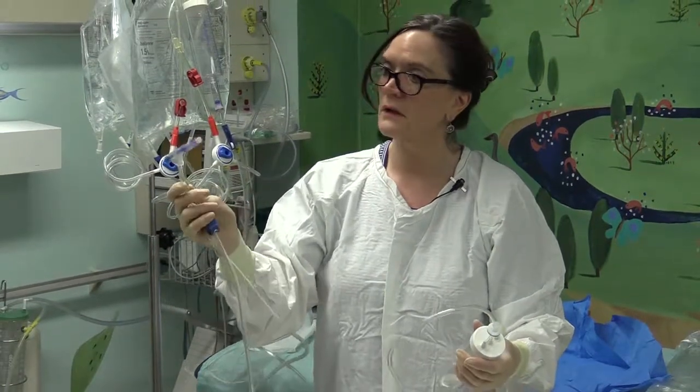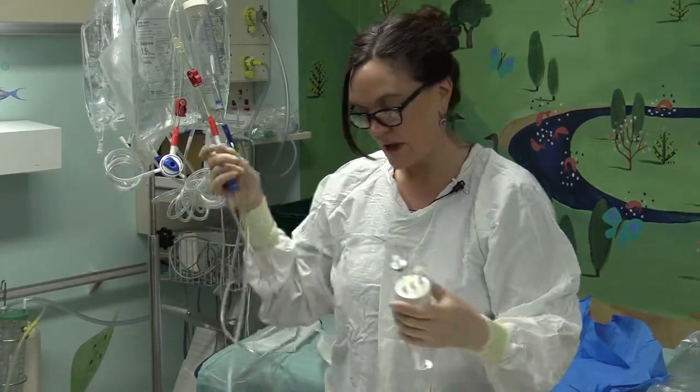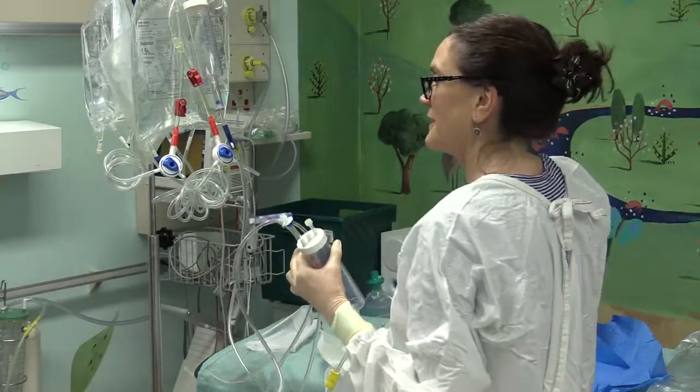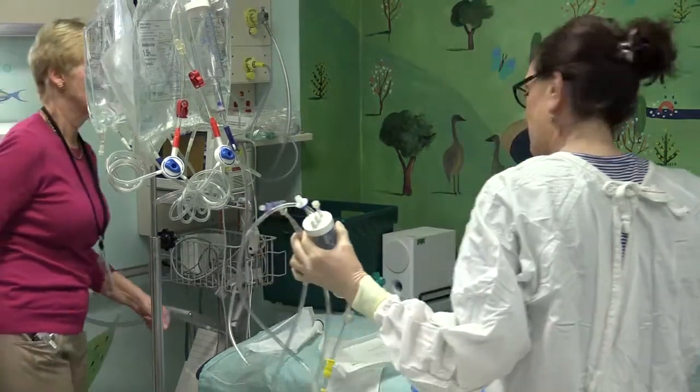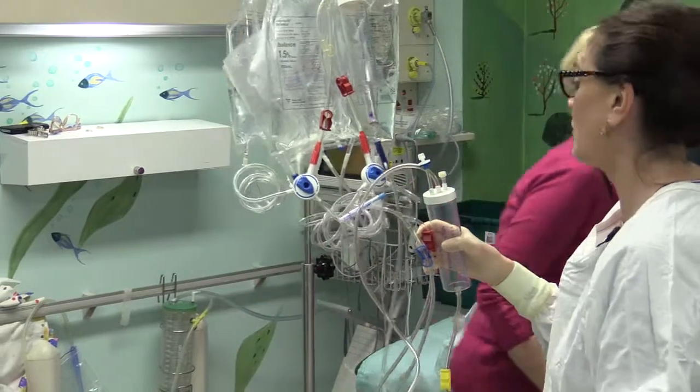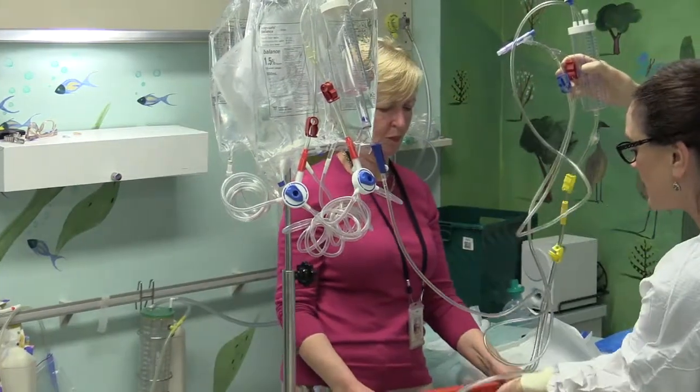So that must be kept clean at all times. Now, my assistant is going to hand me the container that I'm going to put the drain bags into to keep them clean and off the floor. I'll just drop them into there without touching.